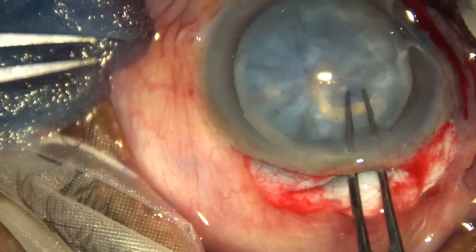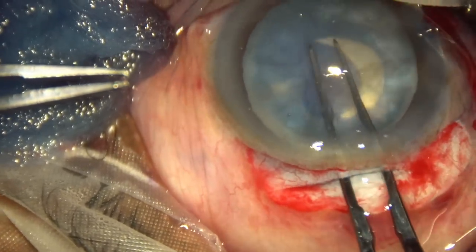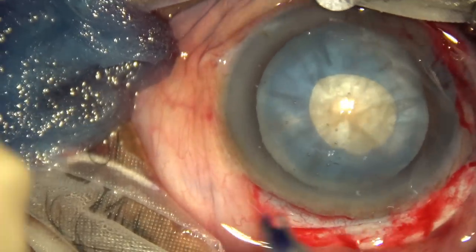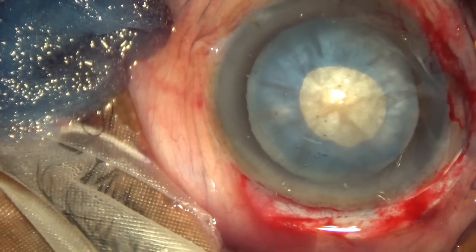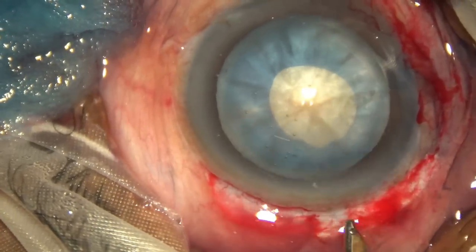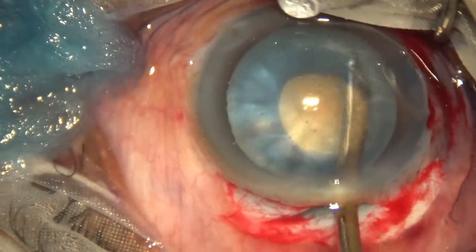So intumescent cataract, and there is a risk of rhexis run out. So what I am doing is, I am going to do some decompression of the capsular bag. That means I am going to aspirate some cortex.